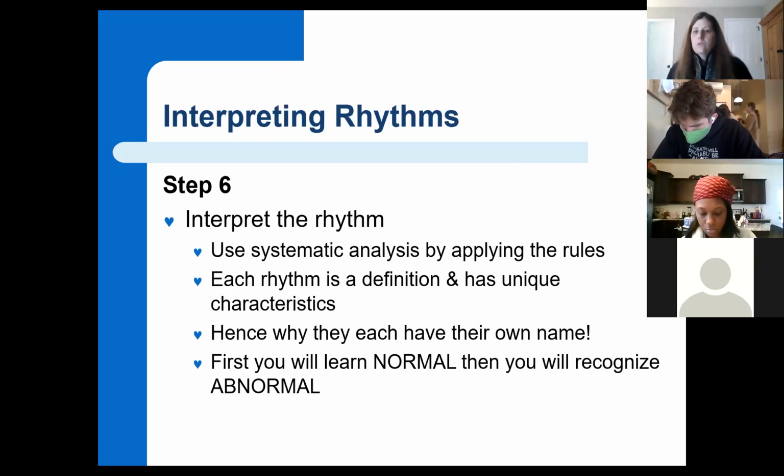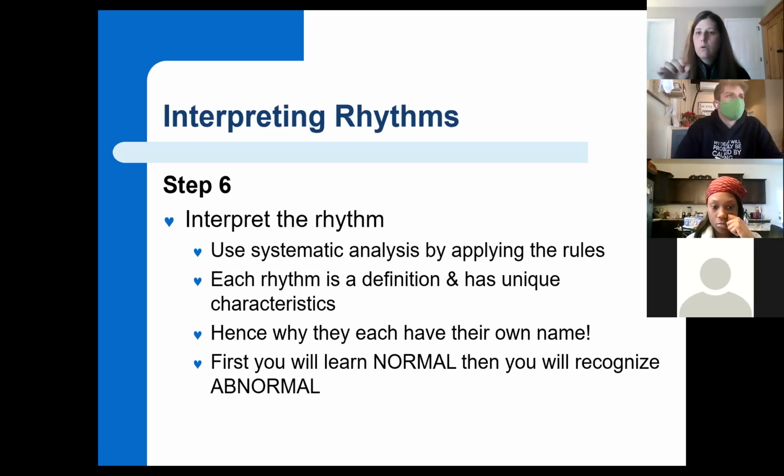The examples on the test are going to be clear enough. You're going to be able to count the boxes. Are there 2 big boxes? Are there 3 little squares? You're going to be able to see that clear enough. You're not going to have to hold a paper up there to measure. Yeah, good question though. Don't stress about that.